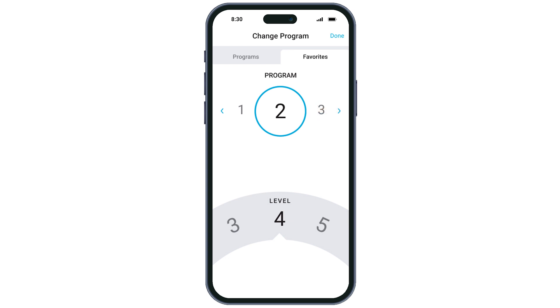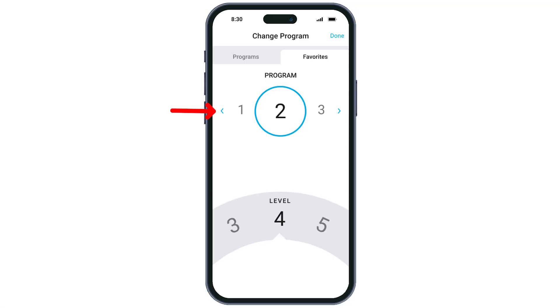To change stimulation, slide your finger to the desired level along the bottom of your screen. If you are instructed by your Nevro HFX care team to change programs, you can move to a new program by tapping the arrow until you see the recommended program.